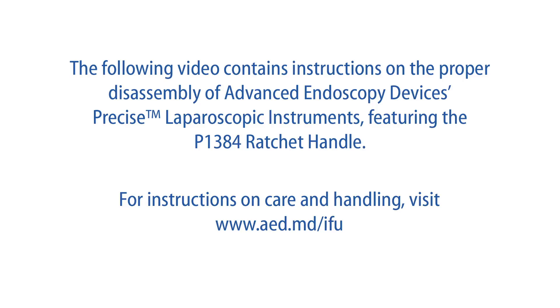The following video contains instructions on the proper disassembly of Advanced Endoscopy Devices' Precise Laparoscopic Instruments featuring the P1384 Ratchet Handle. For instructions on care and handling, visit www.aed.md/ifu.